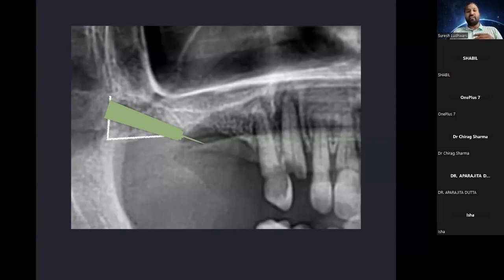The important thing here is the steeper the implant, the more difficult it might be for you to rehab. What I have planned will require a multi-unit which is up to 55 degrees, and there are not many companies which have such a multi-unit. I'm not a prosthodontist, but I can give you a faint idea of what difficulties I face. You need to consider this while planning, that the more upright the implant is, prosthetically that might be much better than what I have planned.